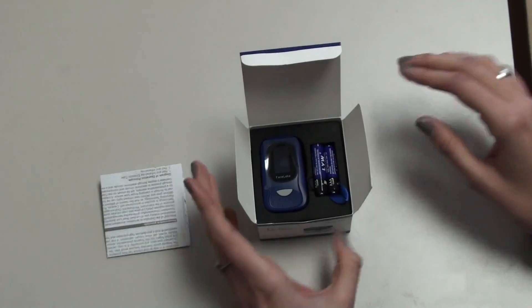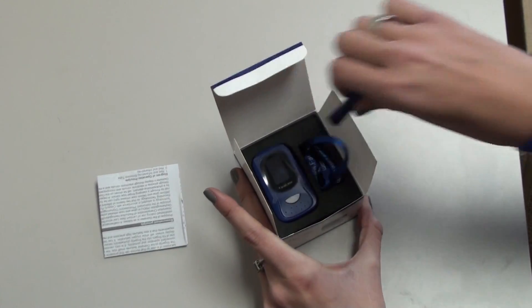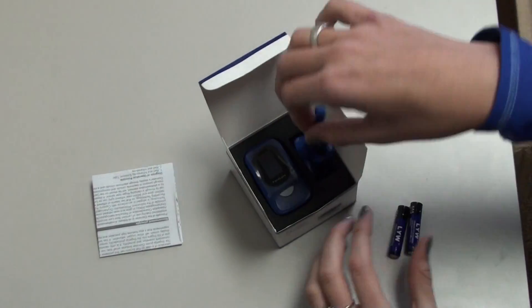First we'll take out the user manual, then the batteries that are included with the product, and this lanyard.